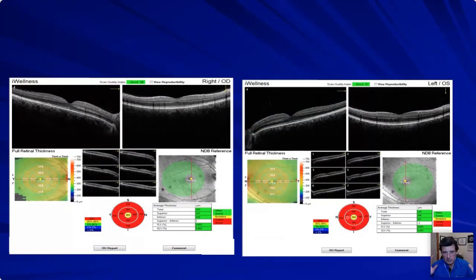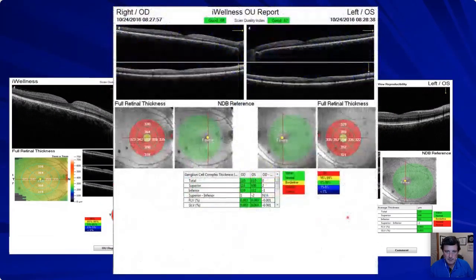You know, is this normal? Is this abnormal? Physiologic? Is there a disease process? Let me put them side by side. And this is why I like looking at the GCC first. Remember, 85 to 100 is what I use in my head. Look at this patient here coming in at 110, 111, 110, 110, 109, 111.